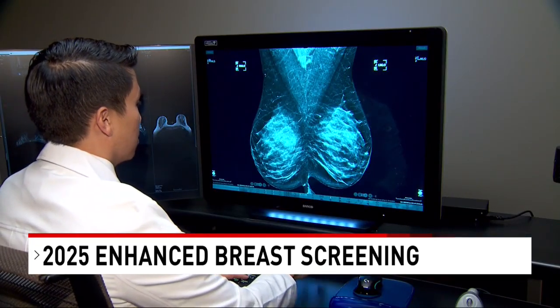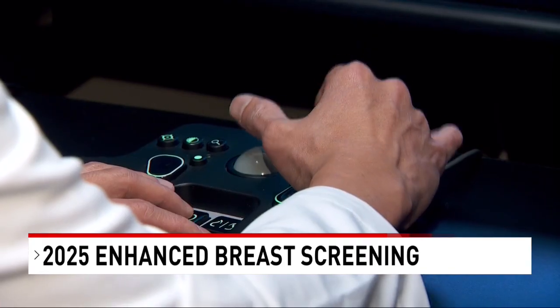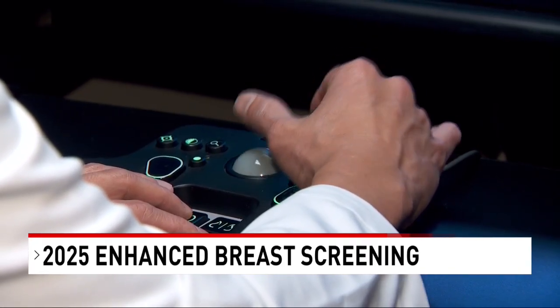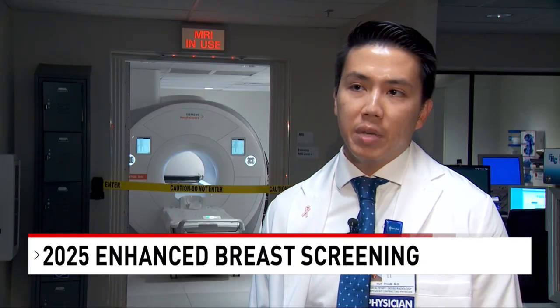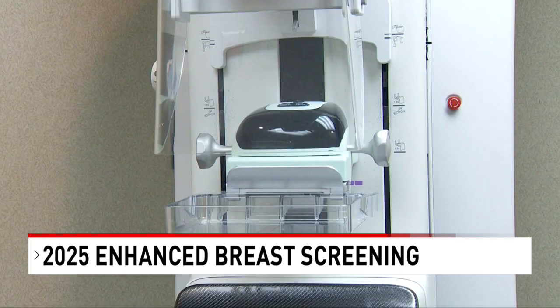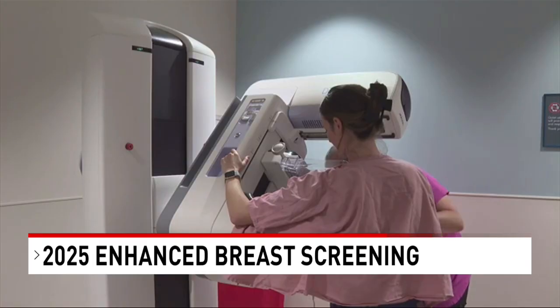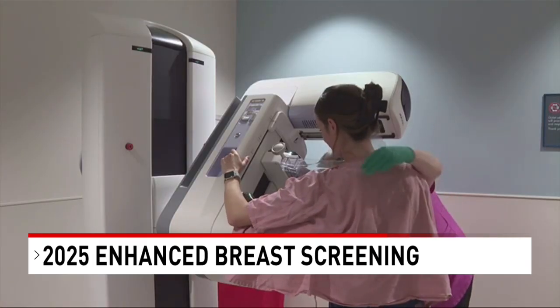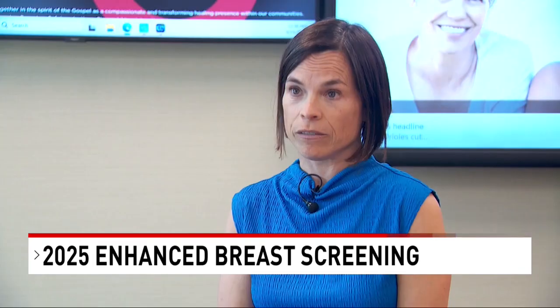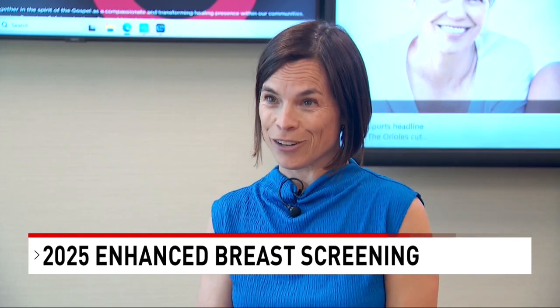But these additions only benefit women who show up for regular recommended screenings starting at 40. We're talking about all these supplemental examinations. However, nothing replaces a yearly mammogram. There are things that mammograms see that supplemental screening may not. Which in Idaho, fewer women show up for than almost any other state. Just getting women in our area in for a mammogram is a huge hurdle that we need to overcome.